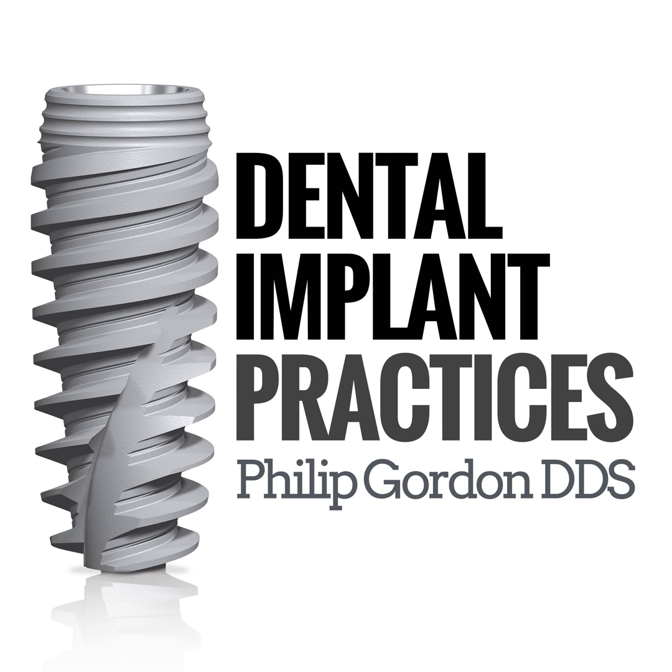We had a patient that was an engineer for Straumann, and Straumann, as you know, the implant company. This is Strawman, the locomotive company. They manufactured trains. And he showed us how you could take two pieces of metal and wedge them together, and it would stay. And I said to Dr. Feigl, gee, this is great. We could have abutments, have implants, have the female part take an abutment and tap it in, and you got it wedged. So that was the precursor of Bicon.